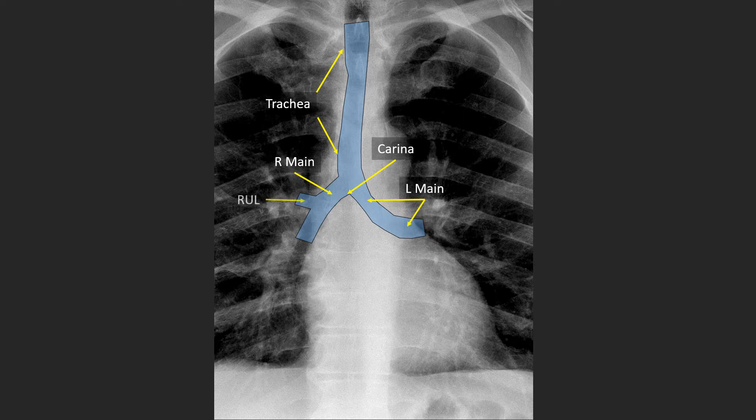The first branch coming off the right main stem airway is the right upper lobe bronchus, which is again very horizontally oriented and short. Beyond this branch point is the bronchus intermedius, which is a vertically oriented airway.